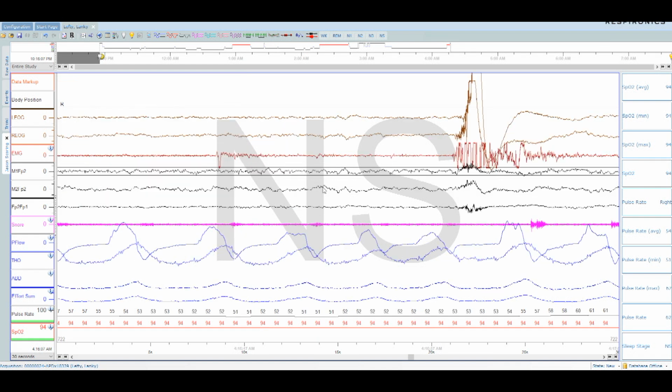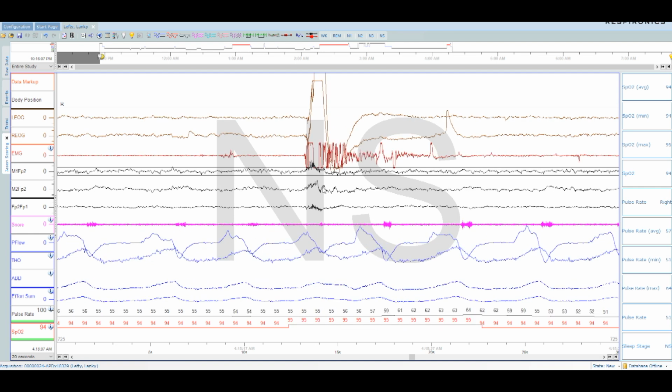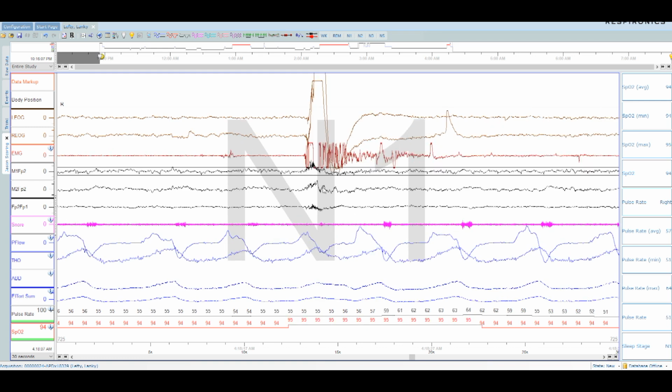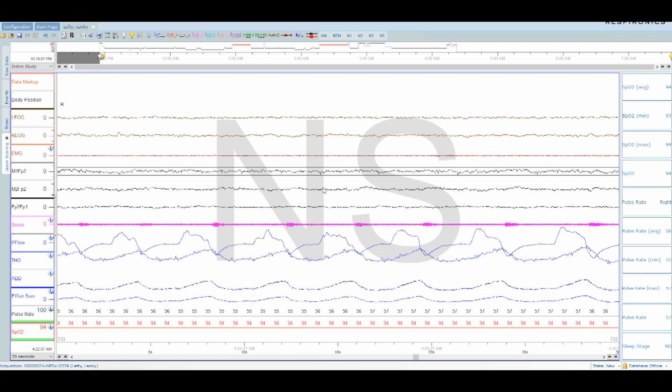So REM, it's wake. Normally 20% is delta. Well, let's start over. 5% stage 1 or N1. Oh God, let me do them in order. Stage 1 is typically 5%. Stage N2 is typically 50%. And stage N3, wow, I just said REM out of nowhere. Stage 3 is typically 20%, and REM is typically 25%. So, I mean, you never actually get that. Those are just averages.